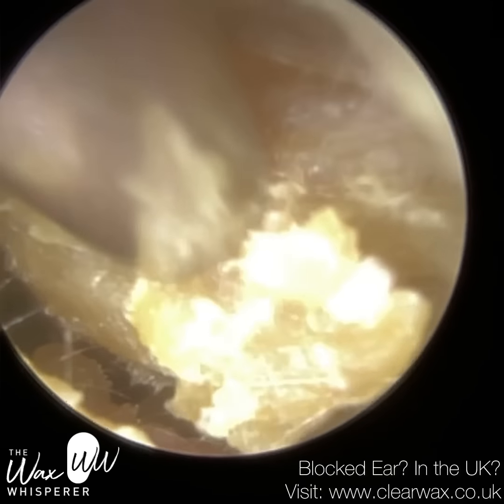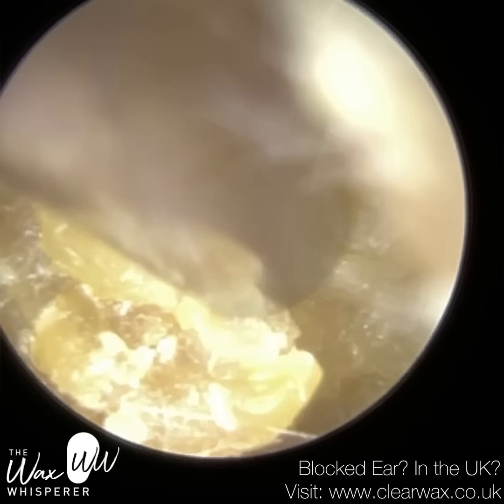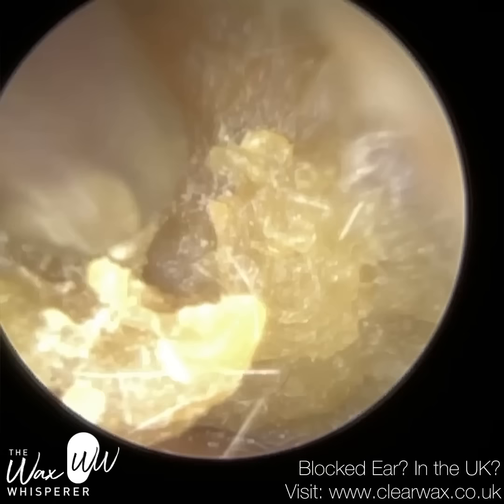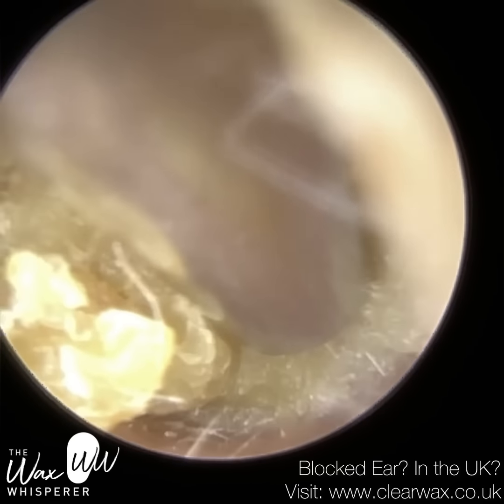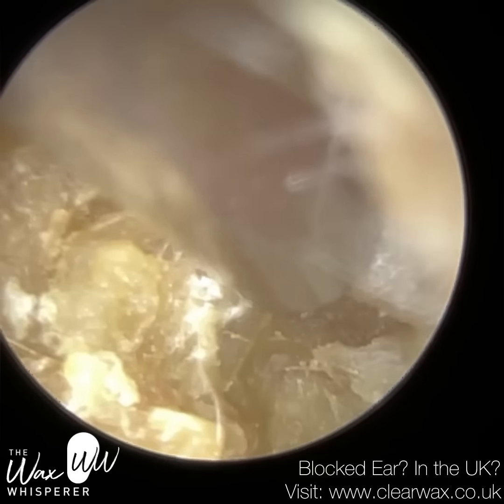So here it's a bit crusty, and then more medially it's a lot softer and mushier. Just to the left of the suction probe, you can see it's quite crusty there, and also this section against the canal wall that I'm trying to elevate away. So you would probably classify that as being a class 2.